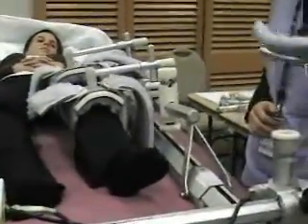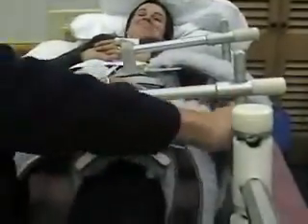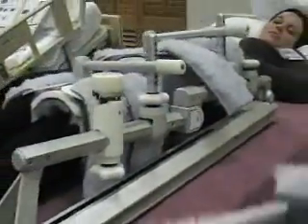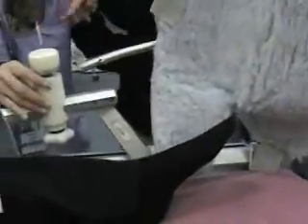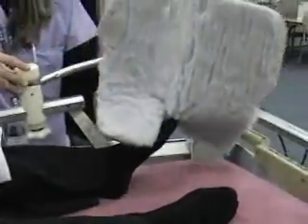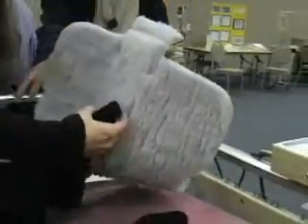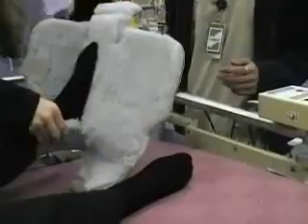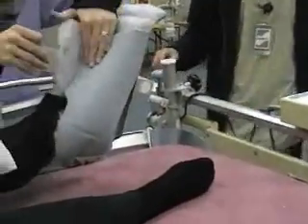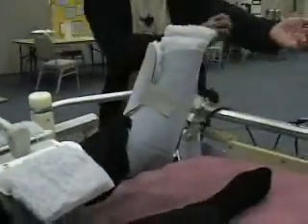Now put the foot pedal on. You can move it up and down or toward the head or foot of the bed by unscrewing it. Unscrew the knob on the bottom — note this is a different knob because it's lefty-tighty. Let it go in, then screw it into place. Put the foot in flat on the foot plate, strap it in, and then lock it down — that one is righty-tighty. Now you're ready to start it.